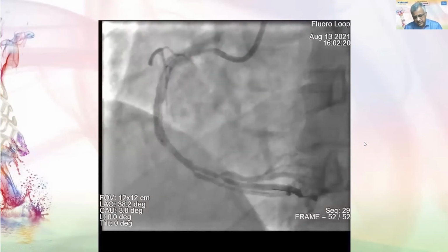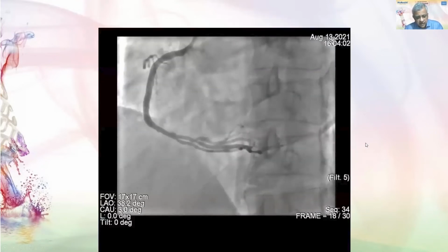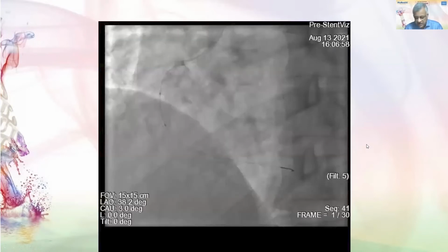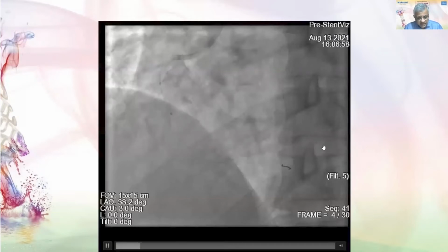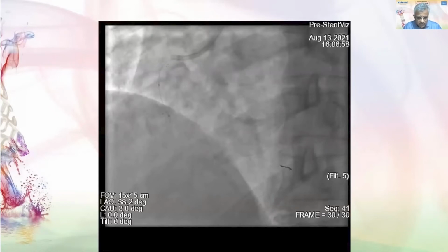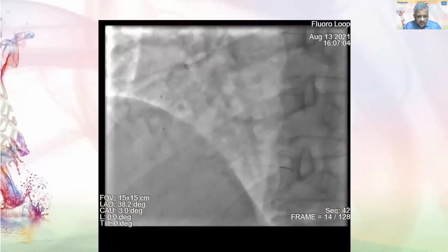It showed a reasonably well approached stent. And then after the second shot, this is to see actually the distal vessel also. Then we went in with the 4.5 into 15 Lineage balloon and did a post dilatation with the distal marker of the balloon and the distal marker of the stent slightly overlapping. So while doing so, we see that a little bit of the balloon does go into the territory beyond the stent, but that's only the tapering part of the balloon.